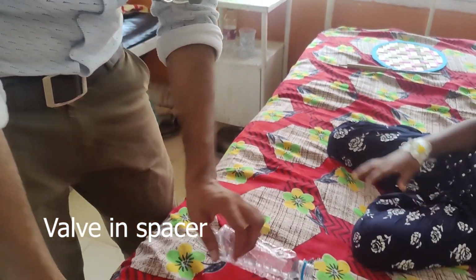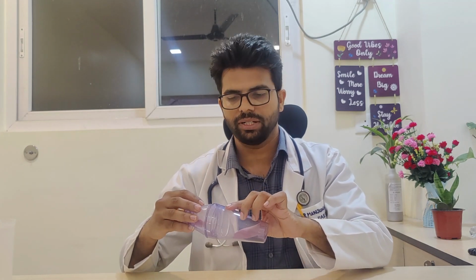The next question is how to clean the spacer and inhaler device. For the inhaler device, you open it, take out the metal canister, wash the plastic part with running water, and dry it. According to IAP, they advise to wash the spacer and mask once a month. Wash this device with lukewarm water, but when you are drying, don't use a cloth. Allow it to air dry. Don't use a cloth while you are drying.